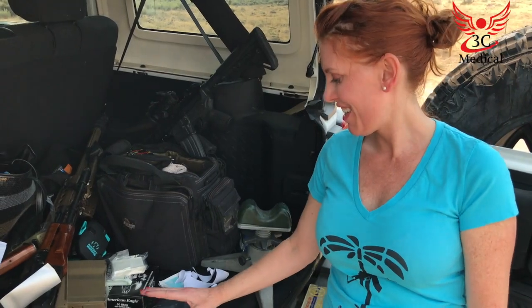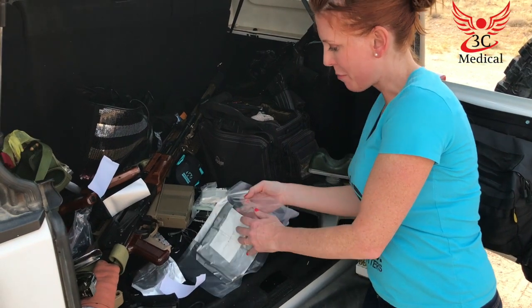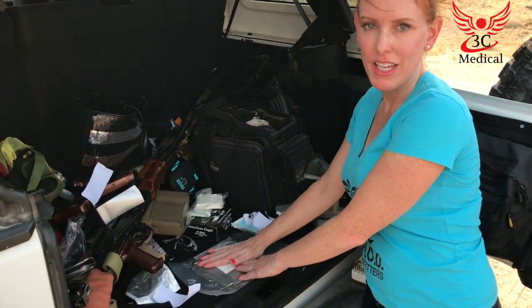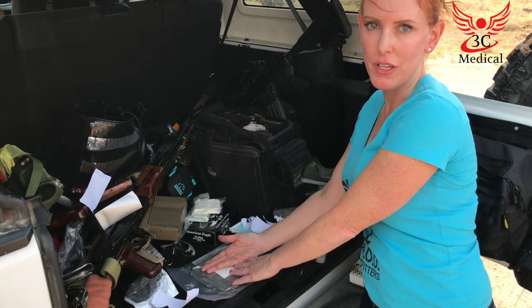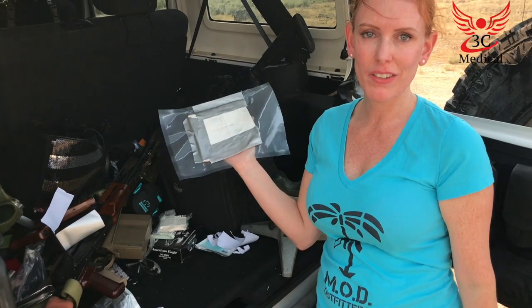We taped the occlusive dressing down on three sides of the wound. The air is still able to escape under here, but it doesn't let air get back in because it's going to suck it down when they breathe in. And that is an occlusive dressing for a sucking chest wound.